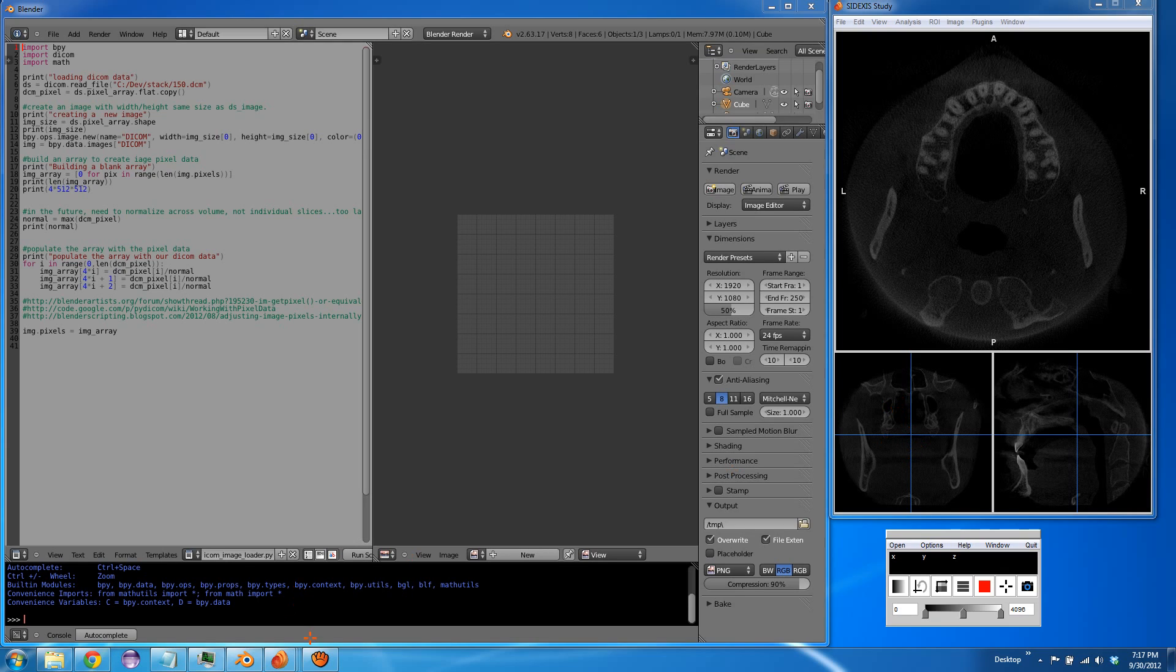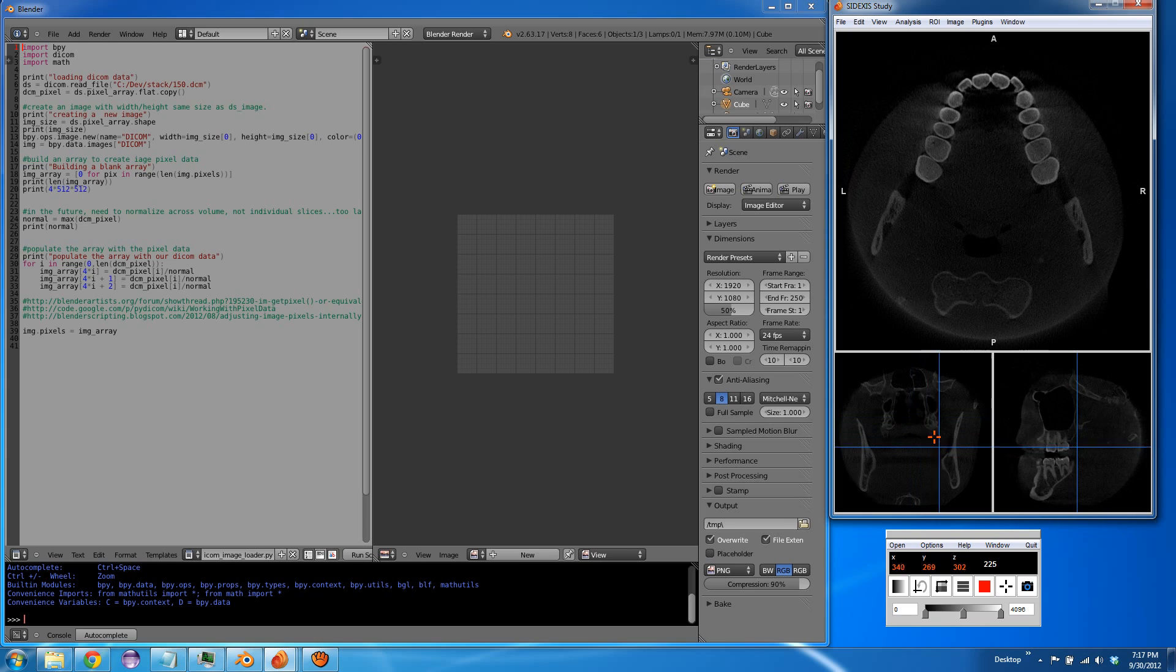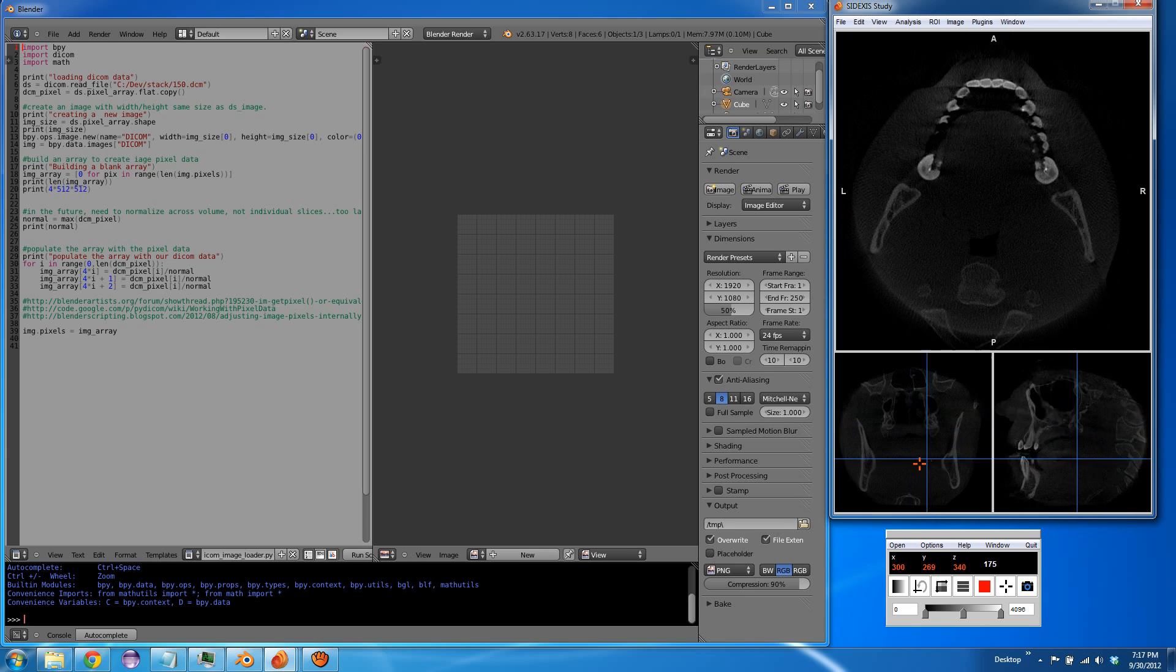Okay, so what I've got over here is the image stack loaded up in Mango, which is no relation to the Blender Mango.